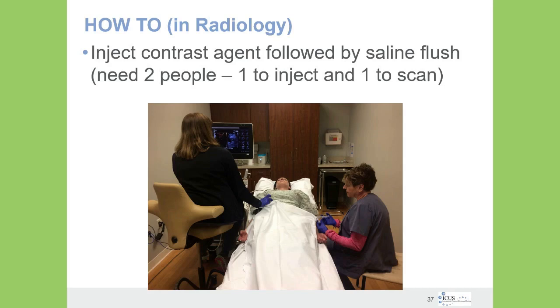Because the contrast arrives so quickly at the organ of interest, it is virtually impossible for the sonographer to inject, turn the stopcock, administer a flush, and have that transducer at the proper location by the time the contrast arrives. So we need someone else in the room for about 5 minutes maximum.